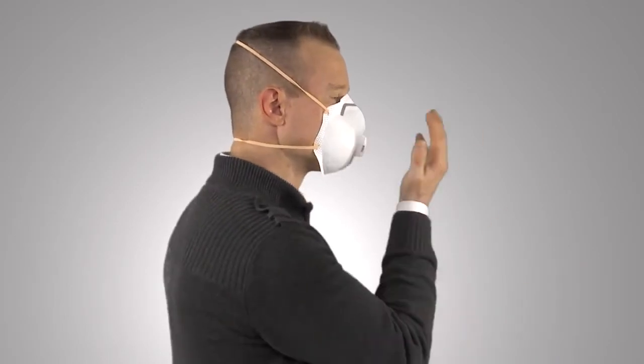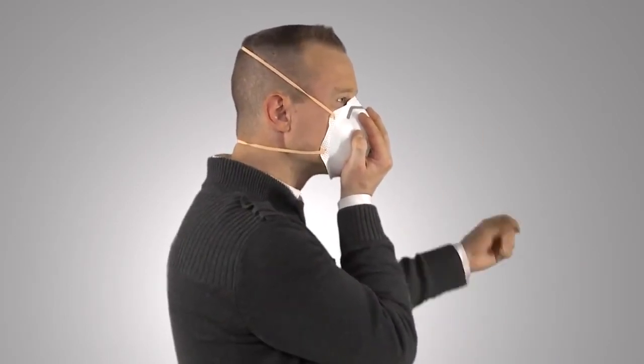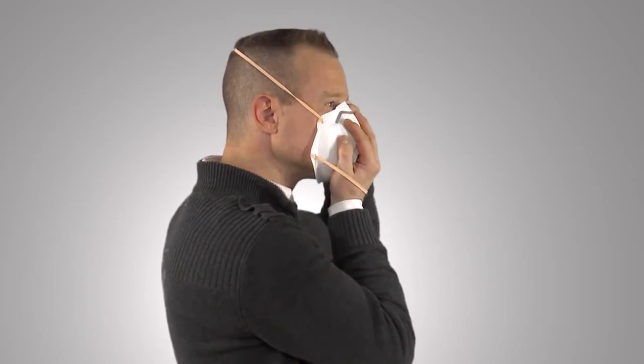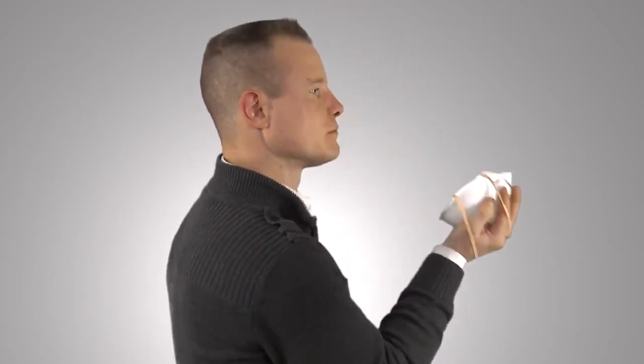After use, to properly remove the respirator: First, cup the respirator in your hand to maintain its position on your face. Second, pull the bottom strap up over your head. Third, still holding the respirator in position, pull the top strap over your head and remove the respirator.